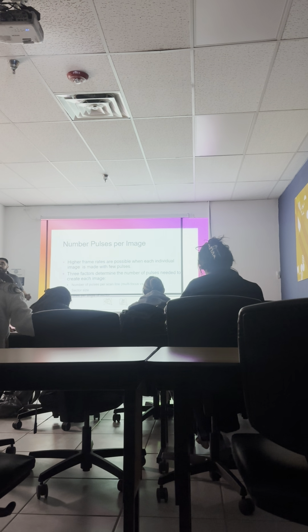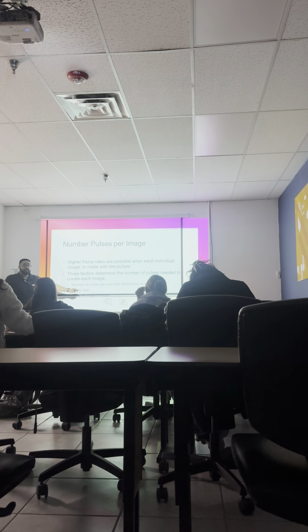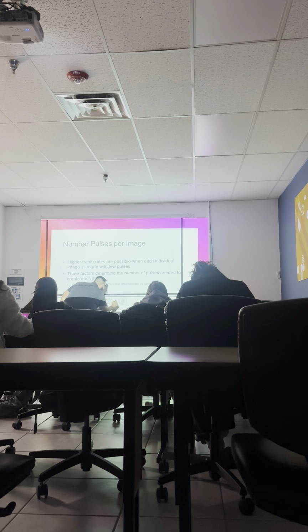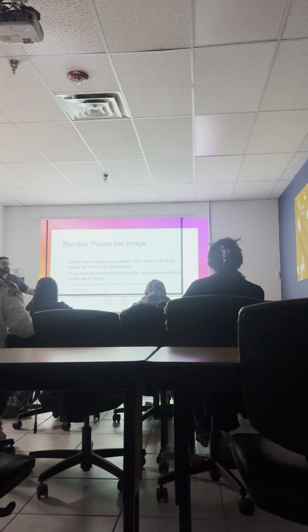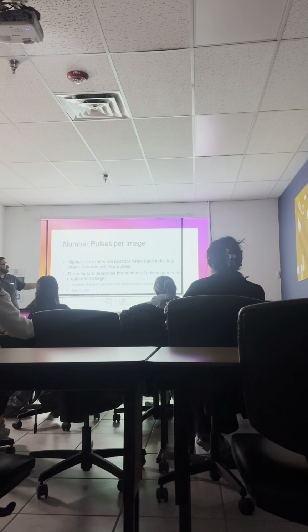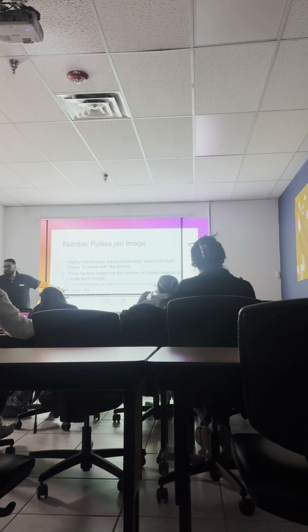Yeah, so this is temporal resolution at this point. So which one of these has a better temporal resolution? A has better temporal resolution because there's less scan lines, right? Okay, but which image looks better? B, because it has more scan lines. Okay, so which one of these would you use to scan the liver? B. And then which one would you use to scan the heart? A, right? Because we need improved temporal resolution, and the heart isn't as big as the liver, right?